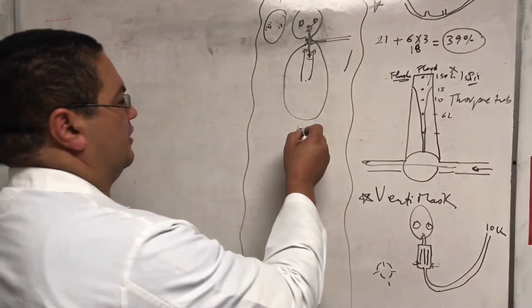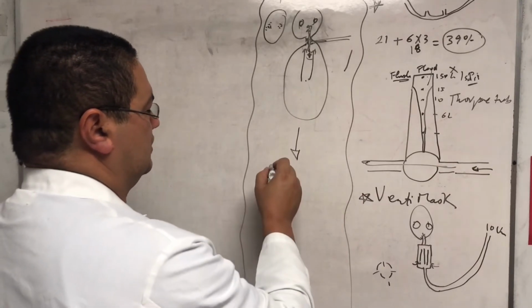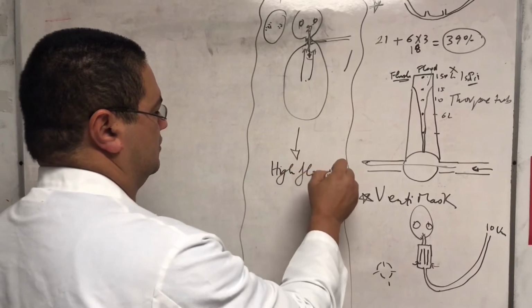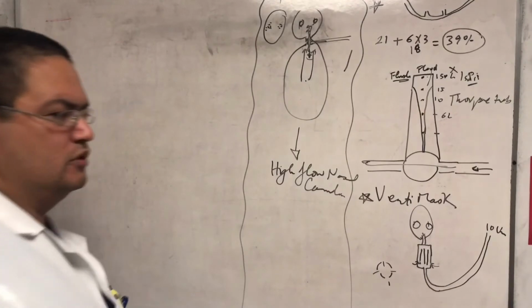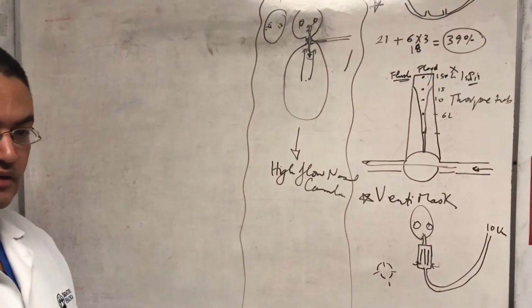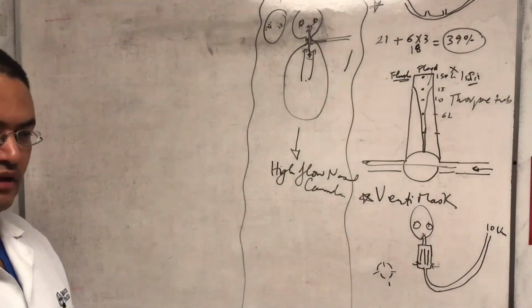Now, let's talk about the high flow nasal cannula. Here in this hospital, we differentiate between the high flow nasal cannula and the heated wire high flow nasal cannula, because we have the two types. If you don't have the two types, it's going to be a problem.